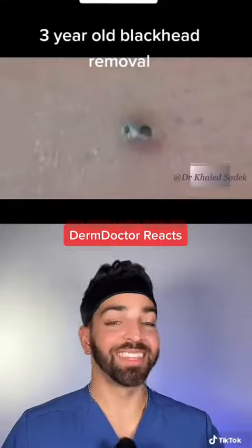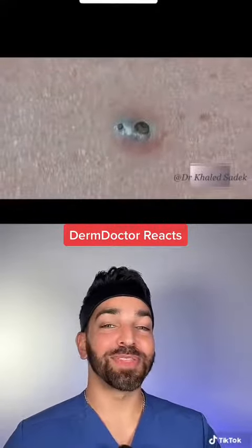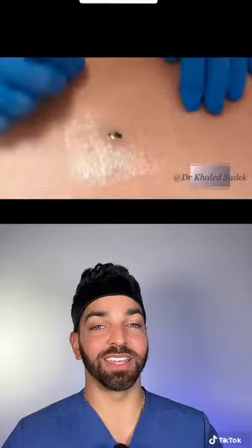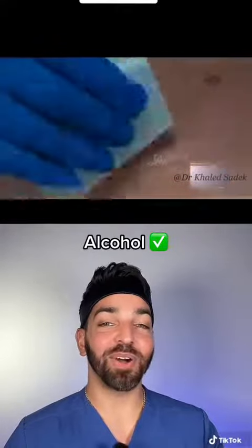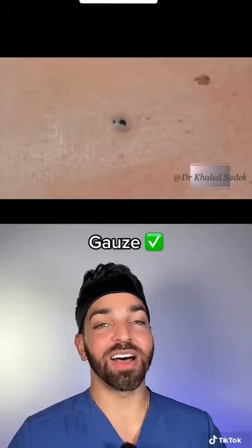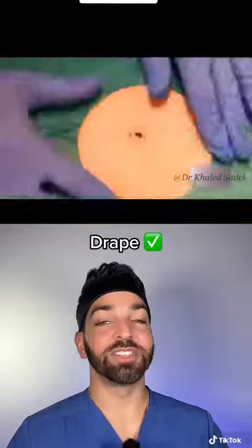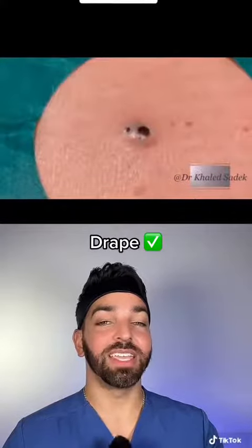Three-year-old blackhead removal. This one has been here for three years, and this doctor based out of England is going to help remove it. He's cleaning the area with some alcohol, wiping it down with gauze, and of course he's wearing gloves. He uses a drape here to keep the area clean.